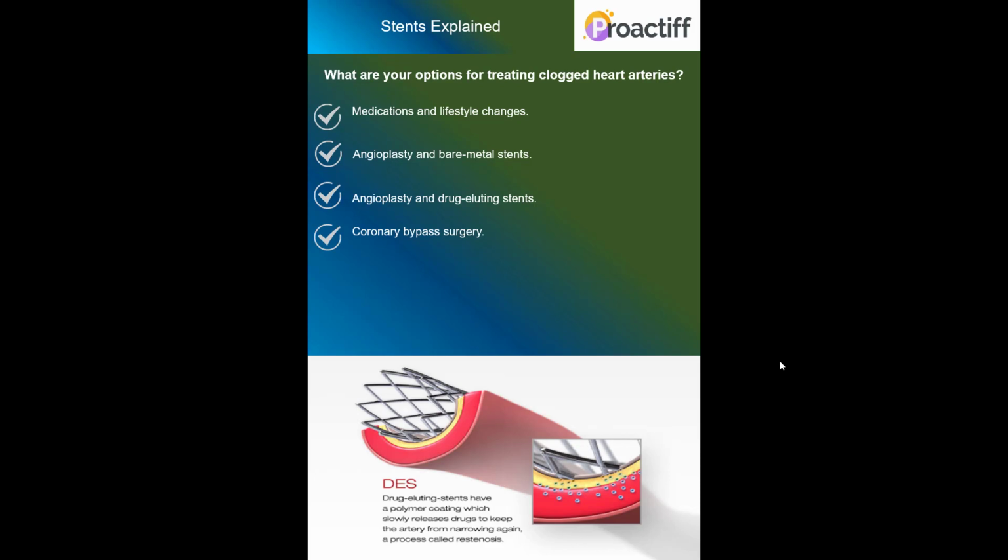So what are the options for treating clogged arteries? One, you have medications and lifestyle changes. Two, angioplasty and bare metal stents. Three, angioplasty and drug-eluting stents. Fourth, the last choice would be coronary bypass surgery. So these are the various options to treat clogged arteries in the heart.